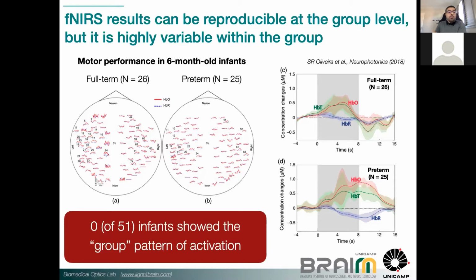And this is actually not true in a lot of systems. This is only true if you have what we call an ergodic system, right? Which means that the group response will be the individual response only if you assume that every member of the group is identical, and if you assume that every member of the group will remain the same in the future. And none of these conditions are true if you're dealing with neuroscience.